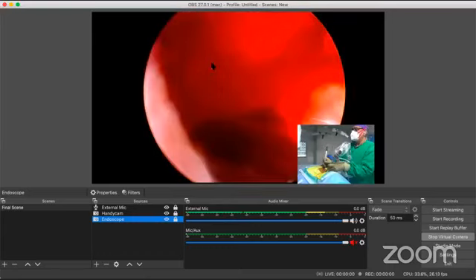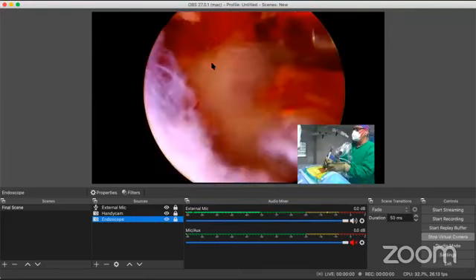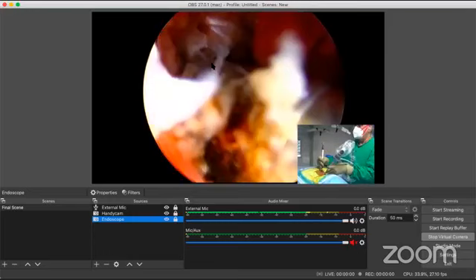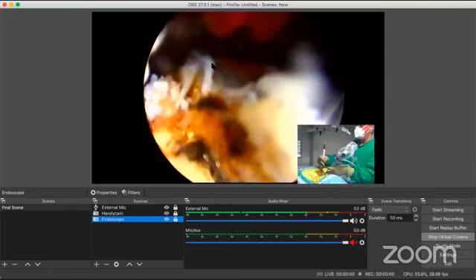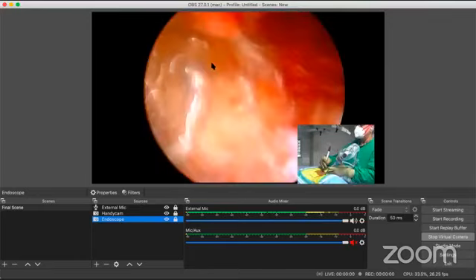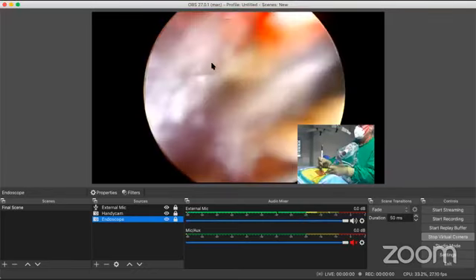It's very easy to get confused and get lost in the cervical spine and to make a mistake, and there's very thin flaval ligament there, nothing much to protect you if you go wrong. So it's better to be wise than to be sorry. Better to take proper regular C-arm shoots until you locate yourself properly onto the interlaminar space. So I'm not going to hurry up anything today.